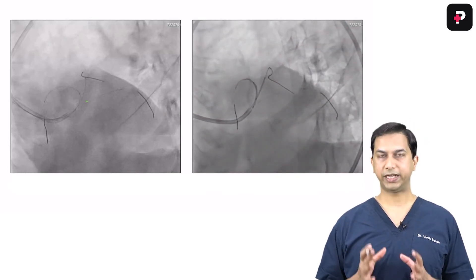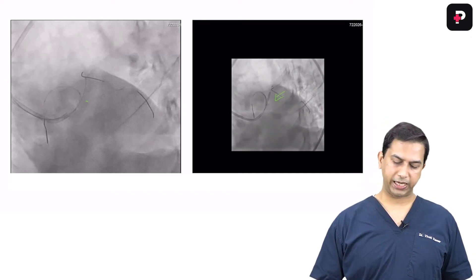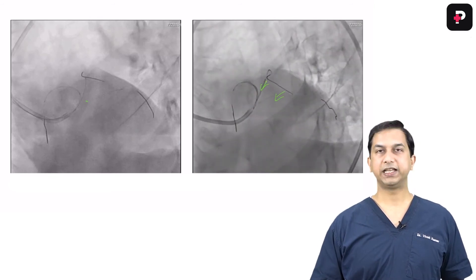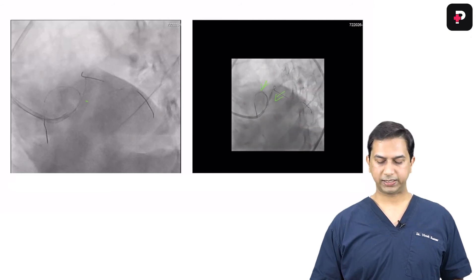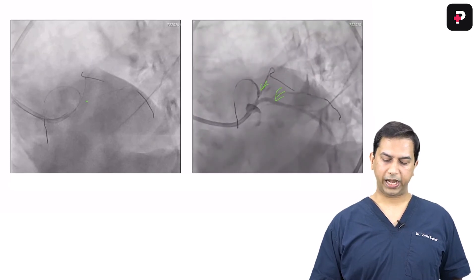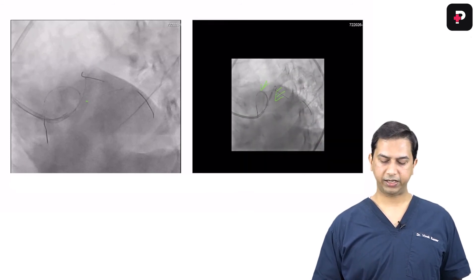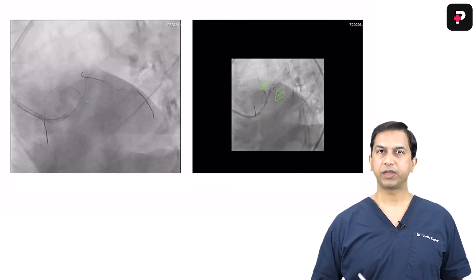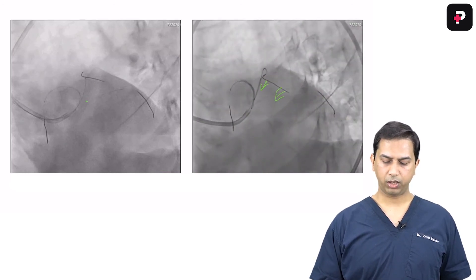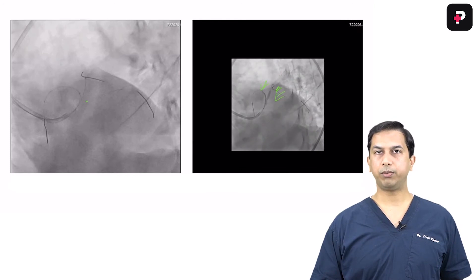Pre-dilatation was done. In a crush stenting strategy, you take one stent in the side branch and the other running from the proximal main branch to the distal main branch. In this case the side branch was the diagonal, so a stent was taken in the diagonal and another stent from proximal LAD. Since we also had to cover the left main, we chose a stent to be deployed from the ostium of the left main to almost mid-LAD, covering the whole lesion length.